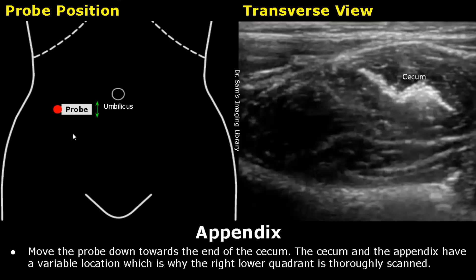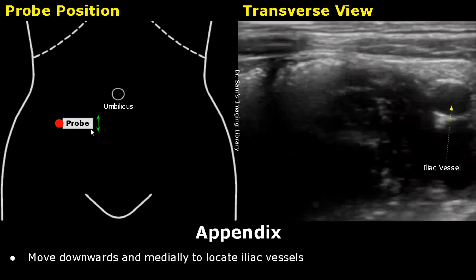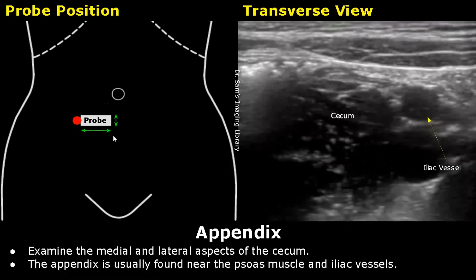Move the probe down towards the end of the cecum. This is done to make sure we thoroughly examine the right lower quadrant and it helps us in locating the appendix if it is not found up till this point. Both the cecum and the appendix have variable location. Move downwards and medially to locate the iliac vessels. Examine the medial and lateral aspects of the cecum. Usually the appendix is found near the psoas muscle and the iliac vessels.